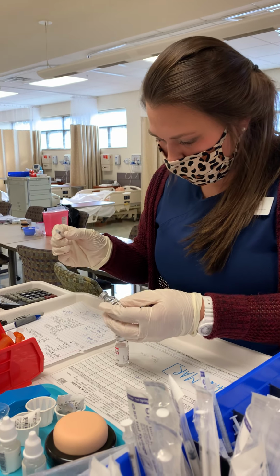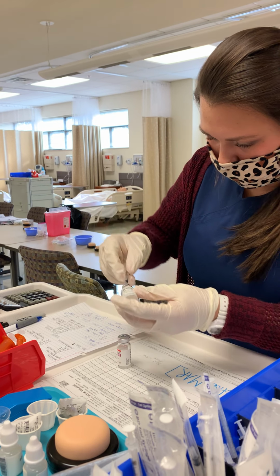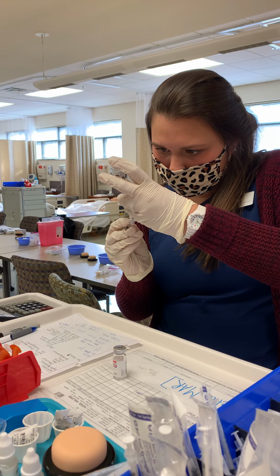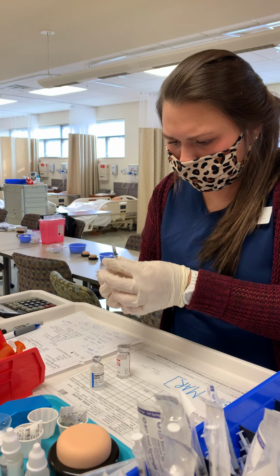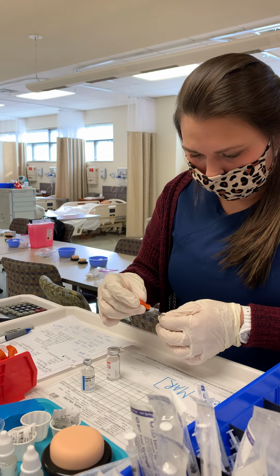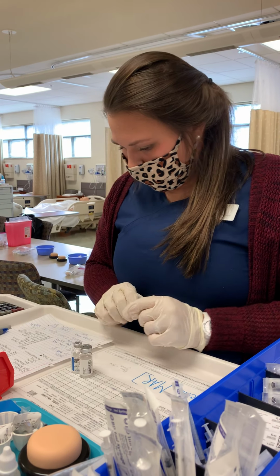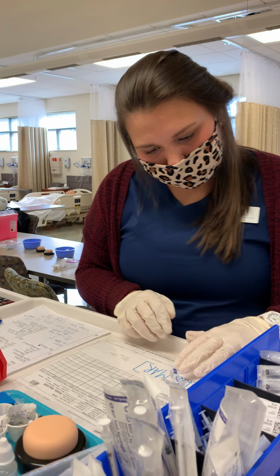And then I'm going to draw 6 units for my NPH. So, total of 11 units of insulin. Check for air bubbles. All right, so I've got my insulin and I have my NPH ready.